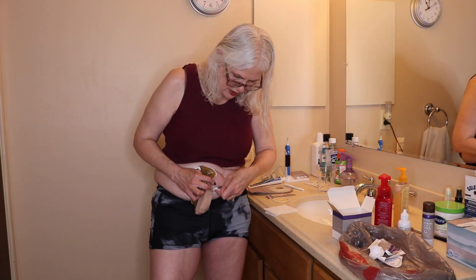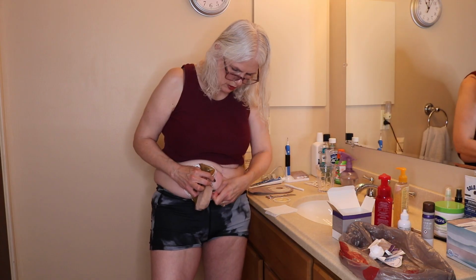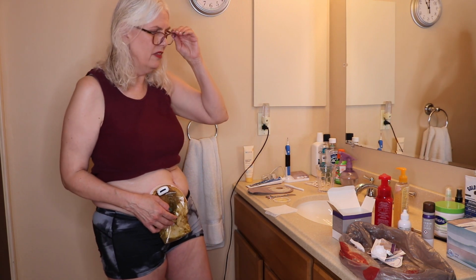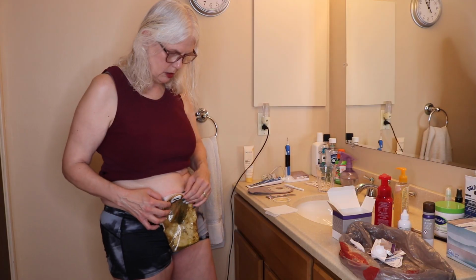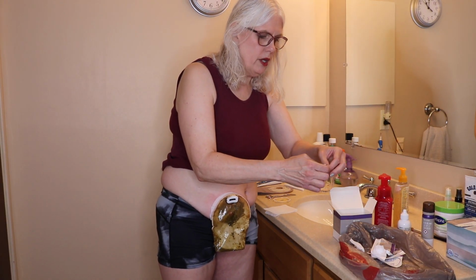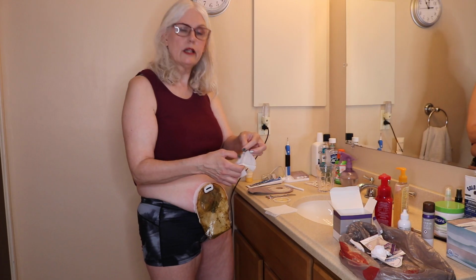Standing here doing all this rubbing to get all this clothing material off actually made me kind of nauseous. I wasn't able to put all that pressure on there, and I felt like passing out, so I laid down on the bed. So I had my husband help me for a little while, while I was laying in bed, and he would help me get the bag off. So yeah, the next time that we went to change the bag, he put it on, and a while later I had a leak.